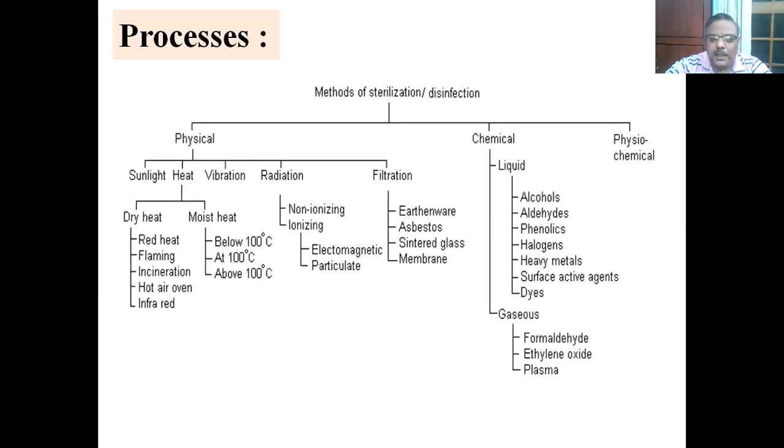Like in our Indian mythology, what our elders say, that fire purifies everything. By fire, we mean that raising the temperature of a body purifies it. So it may be by sunlight, it may be by heat, direct heat, or raising the temperature by any means. Radiation, filtration, these are all the physical means.